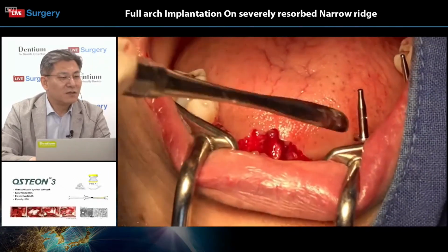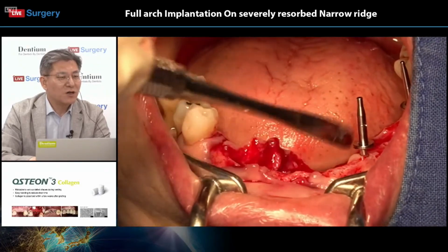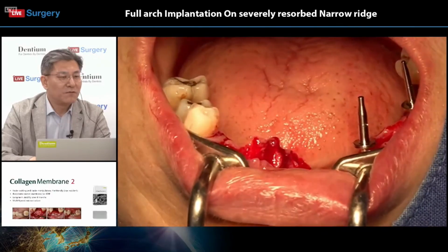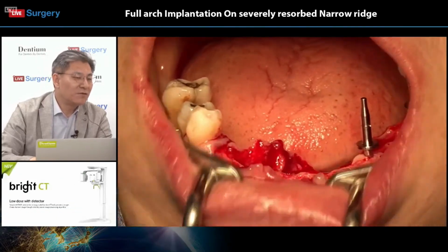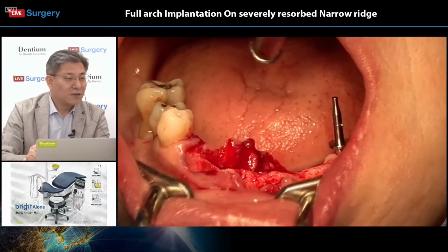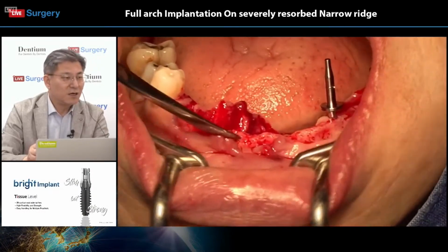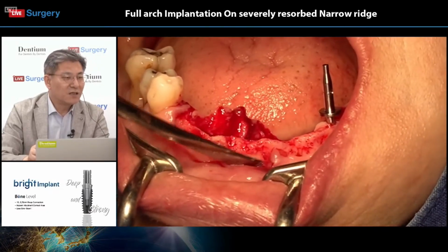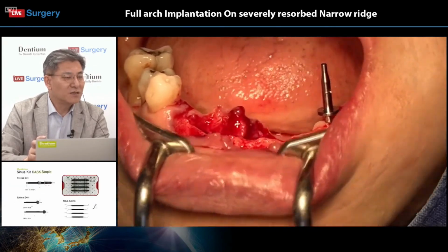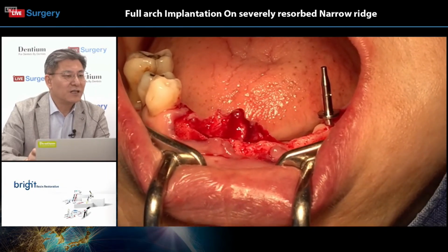At the moment, Dr. Chung has already done two implant positionings. Number 40, maybe number 45 and number 47. Oh, the anterior side, number 43 area. Yeah, I guess number 43 and number 47 areas have already had the positioning done.